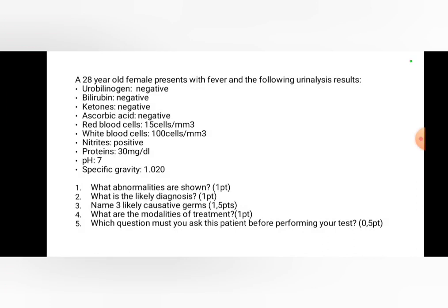Now, the next one after the nephrotic range proteinuria is what is called the glomerular range proteinuria. The glomerular range proteinuria is when you have 2+ and 3+. Is it clear? In this case, when you do analysis of urine for 24 hours, the loss is going to be between 1 gram to 3 grams per day. That is a glomerular range proteinuria.